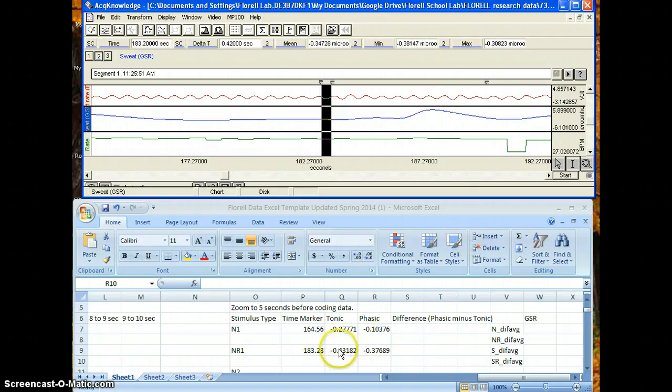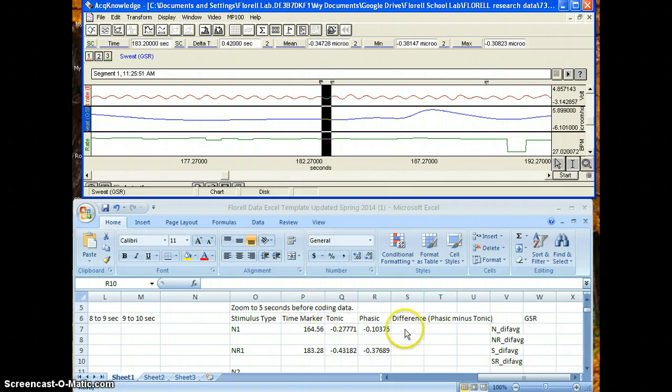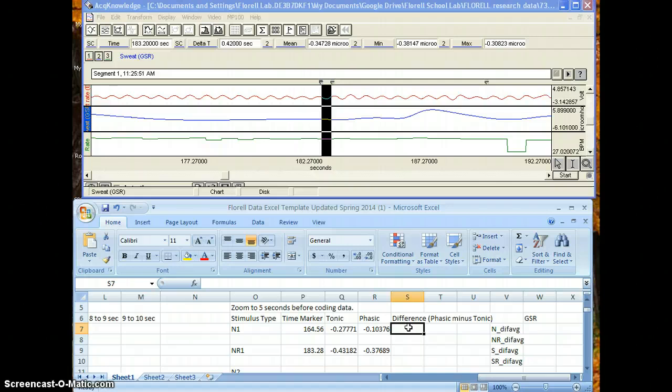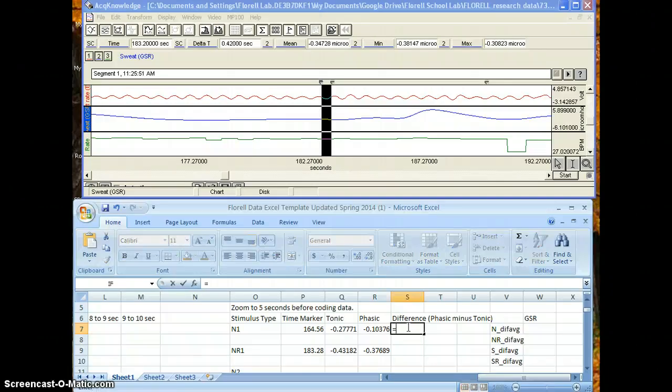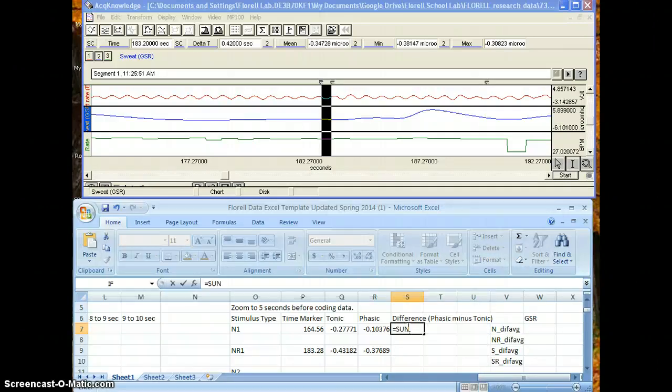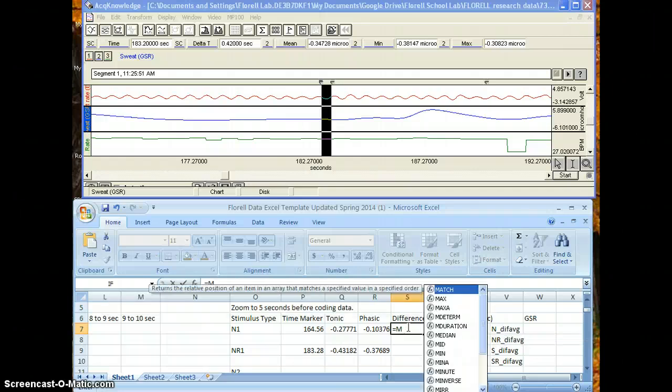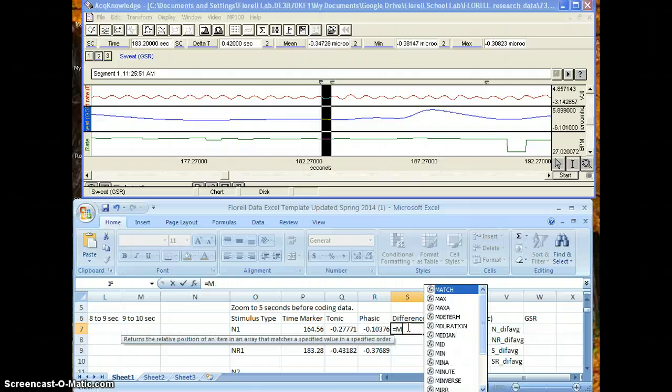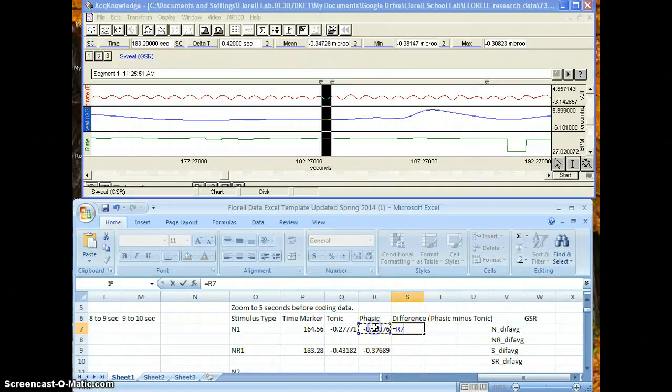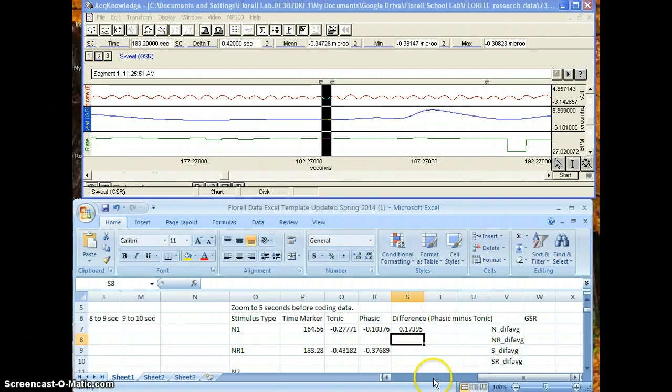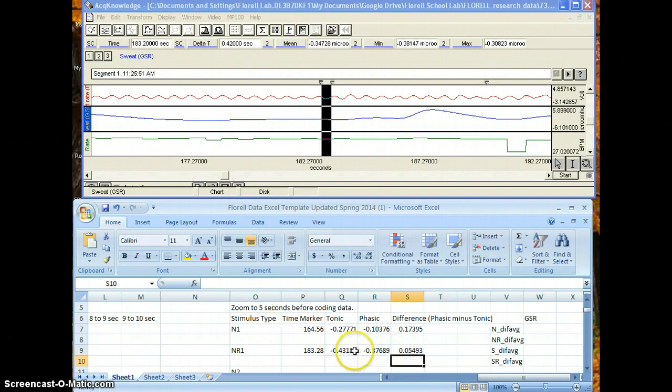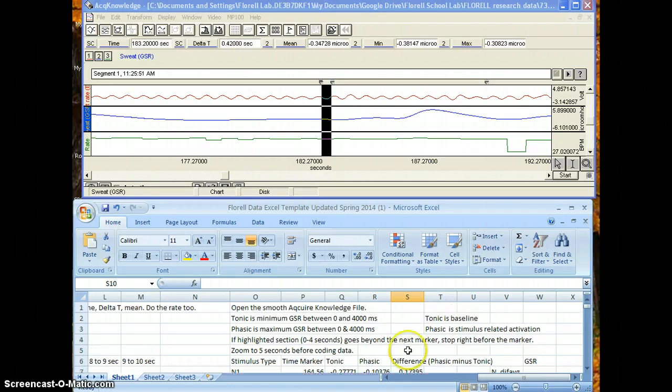And once again, your tonic number is the min number here and your phasic number is the max number here. So then you do that same process all the way down to CR1. And to take the difference in this column, you just do phasic minus tonic. So you would do difference equals, click this and then minus and then this. And you do the same thing, R minus Q, and you do that all the way down until CR1 is your last one.